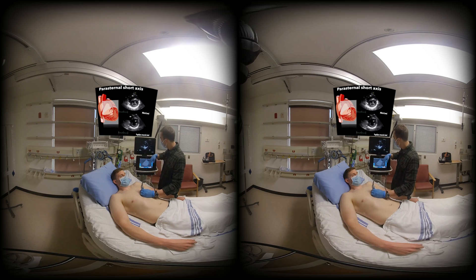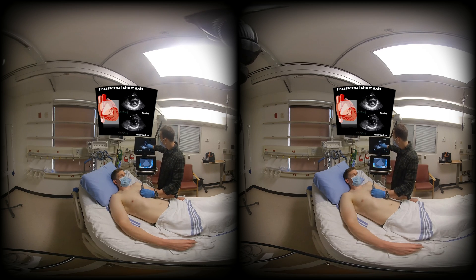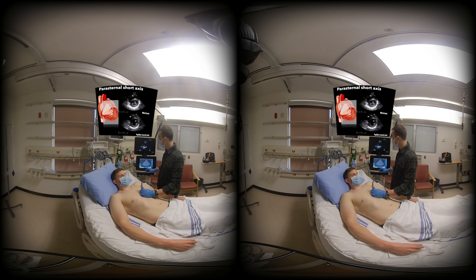As I change the tilt of my probe towards the base of the heart, I can see the mitral valve in the fish mouth view. Angulating the probe a little bit more towards the apex, I can now see the papillary muscles very clearly. In this view I'm looking at some of the same things as the long axis — I want to see that the chamber is changing by about 30 to 50 percent during systole, and I want to see that the walls are thickening nicely during systole. In this healthy patient, the walls thicken normally and the cavity changes in its dimensions appropriately.